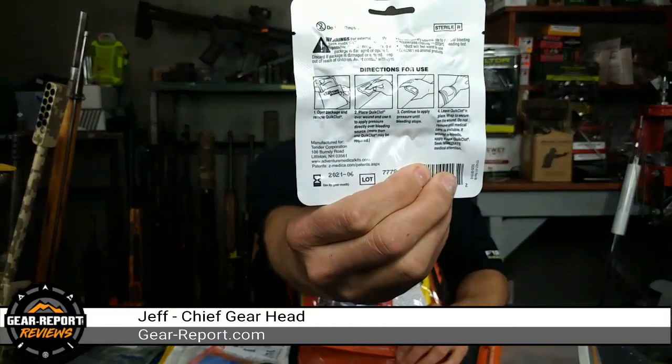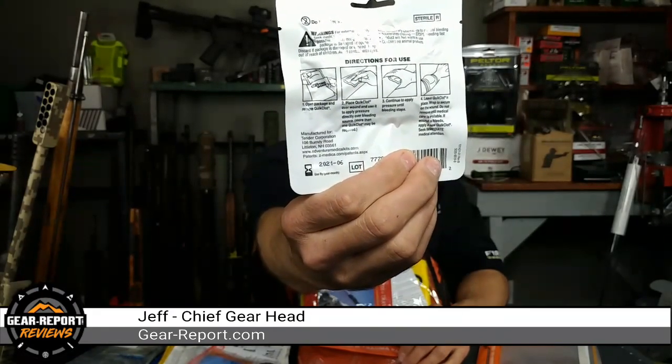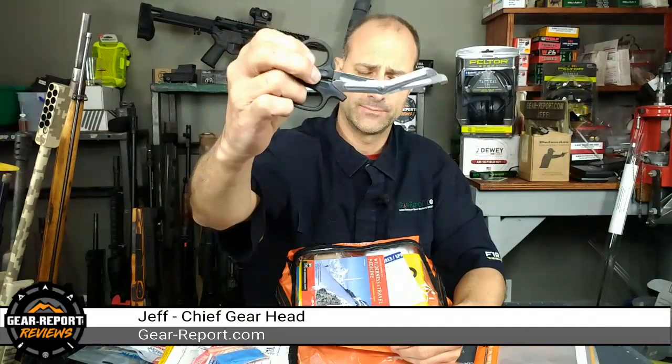QuikClot Advanced Clotting Sponge. This is pretty neat. So you put this under a wrap to arrest bleeding, and it has a clotting agent that will help stop that as well. That's pretty cool. Shears, obviously. Regular scissors have some risk of doing more damage than good, so most medical people carry shears like that. Another pair of gloves, again the nitrile, so latex-sensitive people don't have to worry about it.